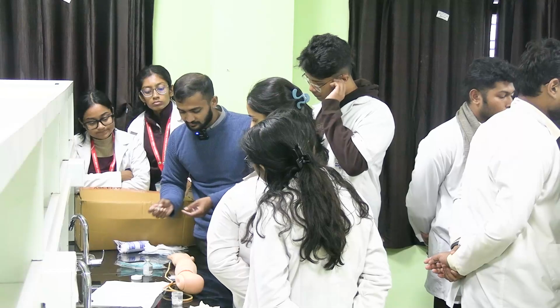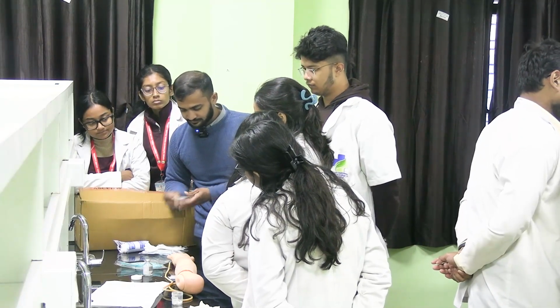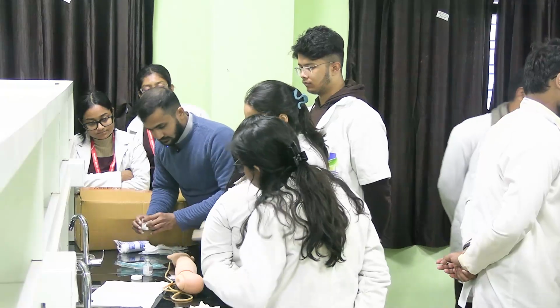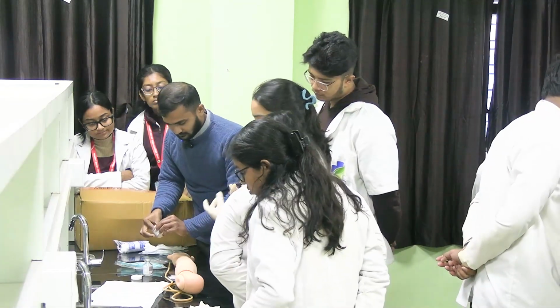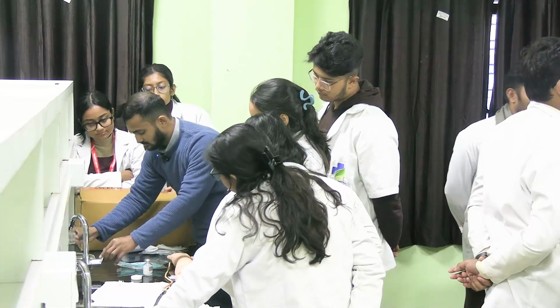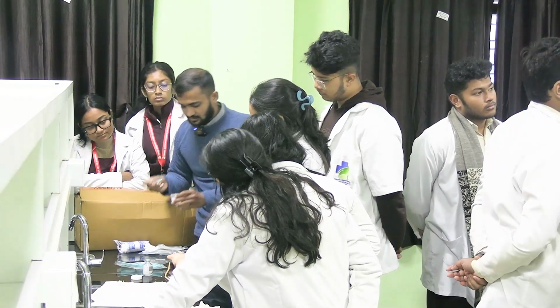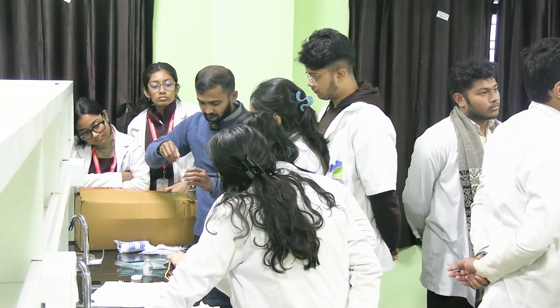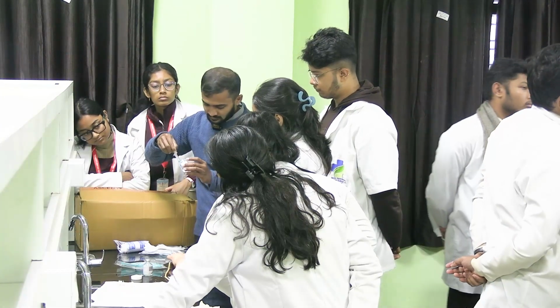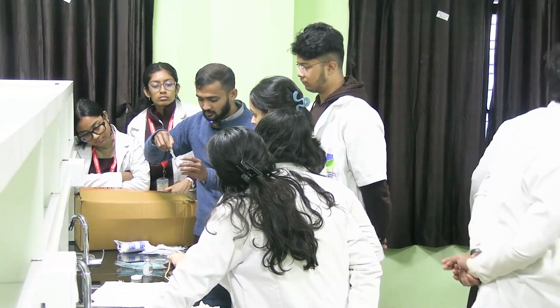Then what is the procedure? After taking this, suppose you have taken the drug from the ampule. You will be taking 1 ml. So if you're taking 1 ml, at least take 0.1 ml or 0.2 ml excess.